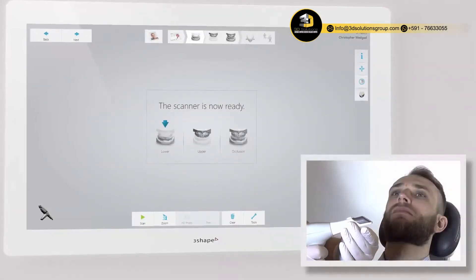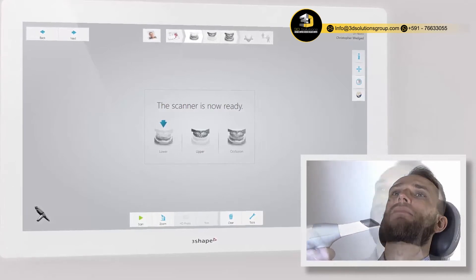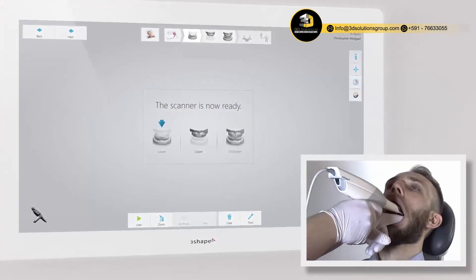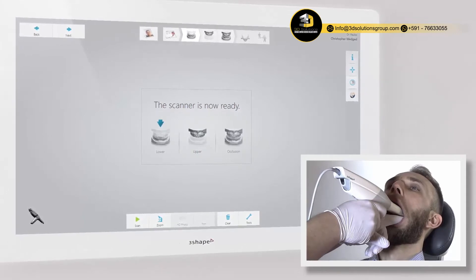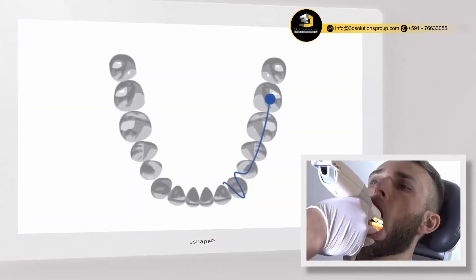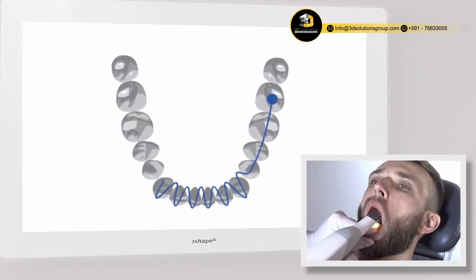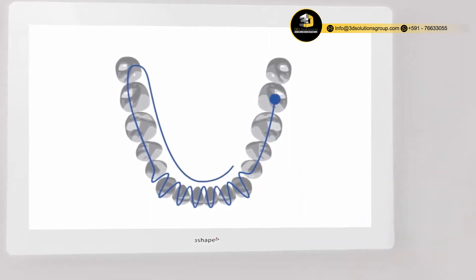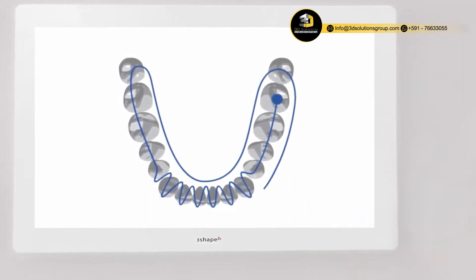Place a clean scan tip on the scanner with the mirror facing down for lower arch scanning. Use your finger or a dental mirror to create space between the teeth, lips and cheeks. The recommended scanning path consists of three sweeps — occlusal, lingual and buccal — to ensure good data coverage of all surfaces.